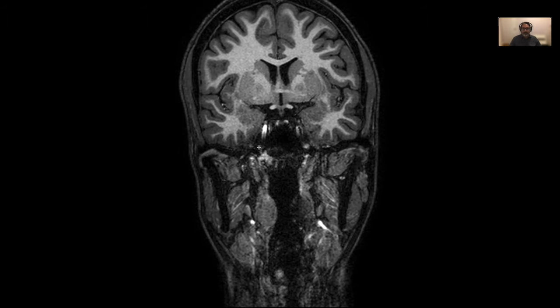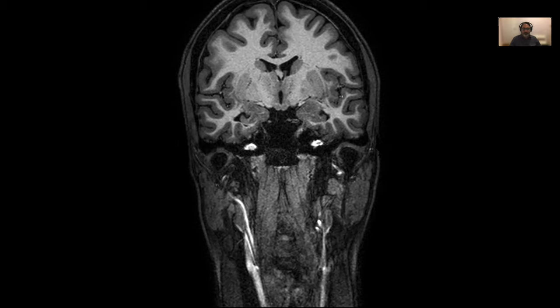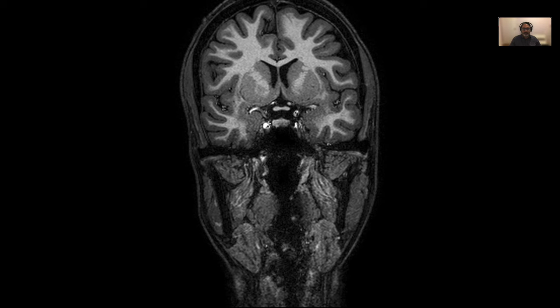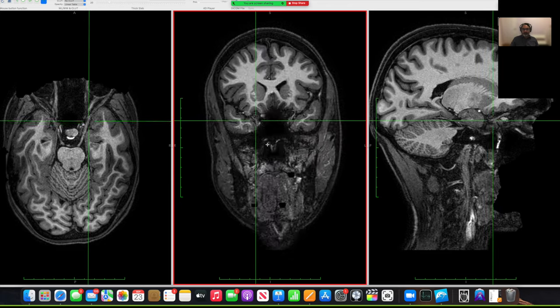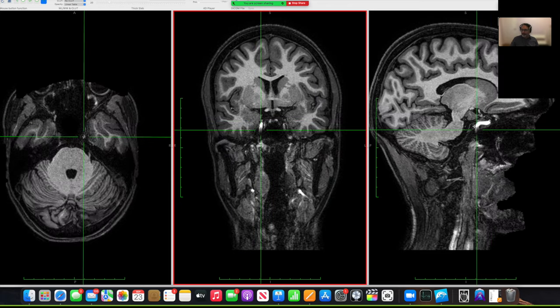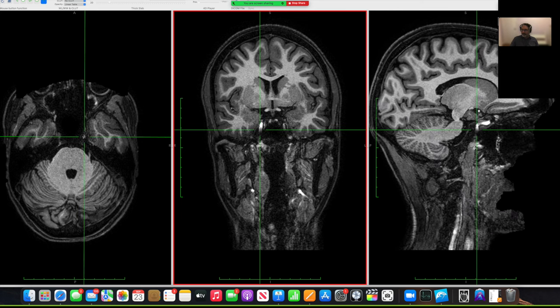Yes, and you can see it go around this way. You can see it come up, go into the carotid canal, be horizontal, then move superiorly, and then have this sinusoidal movement, and then at this level it becomes the circle of Willis. You can sort of see that at all levels. This is where it's moving superiorly, and you can see how it has that curve up there.